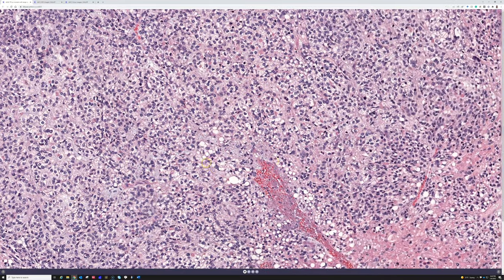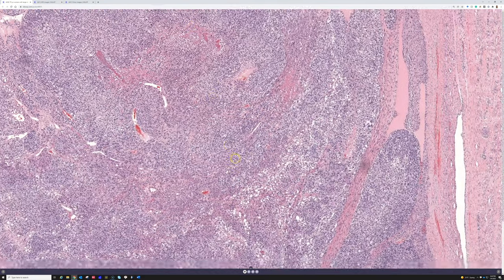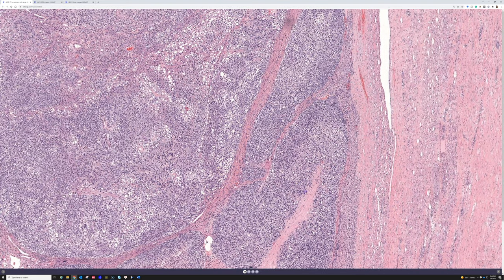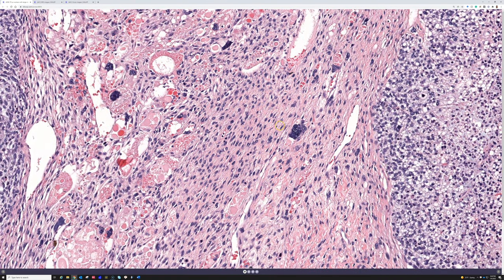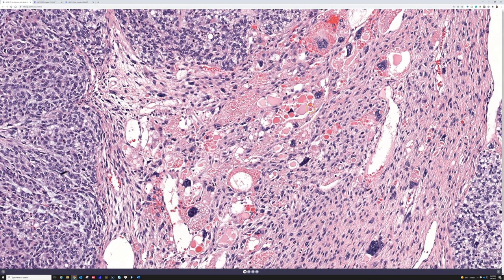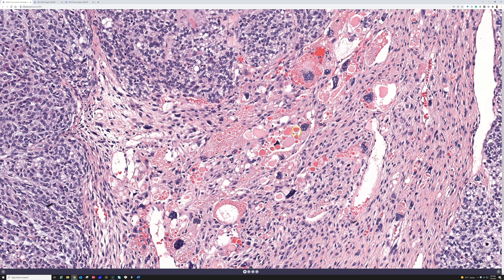This case has lots of lipoblastic differentiation, epithelioid areas, and spindled areas, plus some big bizarre pleomorphic cells. I've noticed — and maybe it's been described in the literature — that pink, hyalinized proteinaceous droplets appear often in the cells of pleomorphic liposarcoma. You can see them in other sarcomas too, but if I see a pleomorphic sarcoma with these pink droplets, I go looking more closely for lipoblasts.